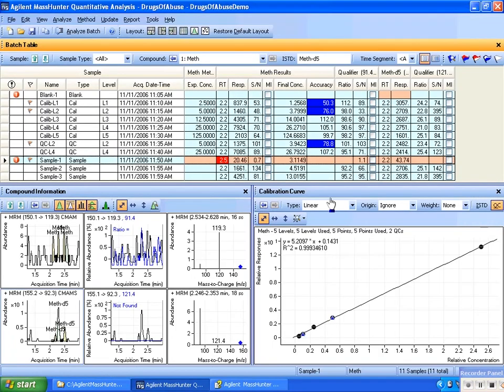So going back to Batch at a Glance, with that particular sample 1, I'll see that the retention time for methamphetamine, the outlier is pointing out it's outside of that particular window, the 10% variation that I expected. And let me convince you that that's true by looking at the graphics.